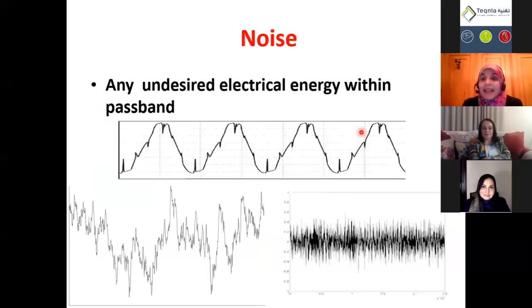We can see non-physiological factors also, and they are more challenging and very time-consuming. The number one and the most important is the noise. We said that the electricity is everywhere and we can pick it up from everywhere. So this everywhere comes to us, and tries to enter the machine. What are we going to do?